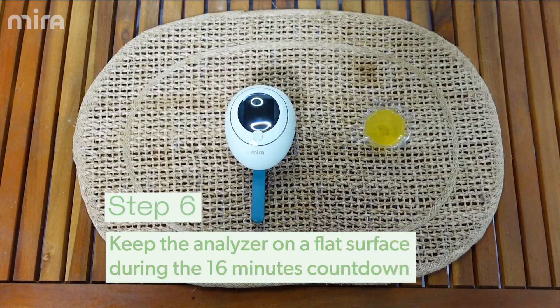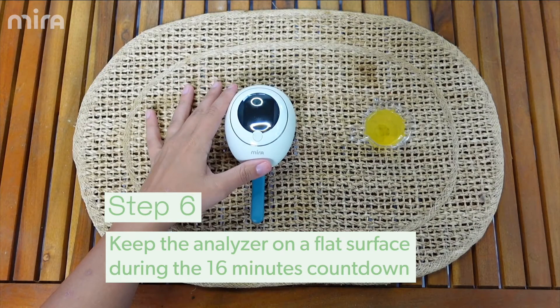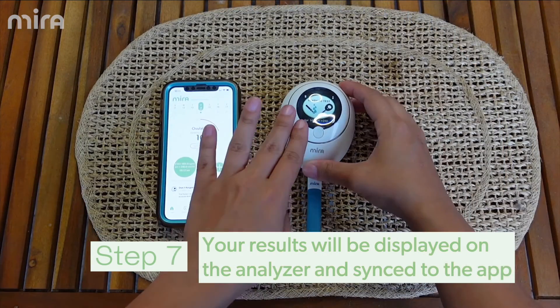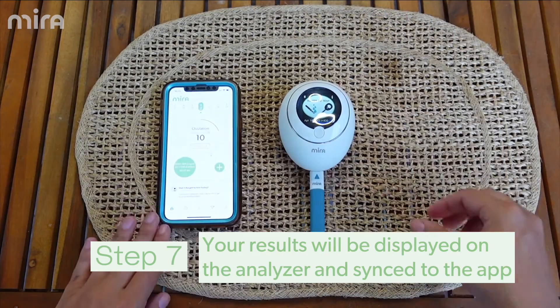Step six, after sampling keep the analyzer flat. Do not move during the 16 minute countdown. Step seven, from there the results will automatically transfer from your device to your phone.